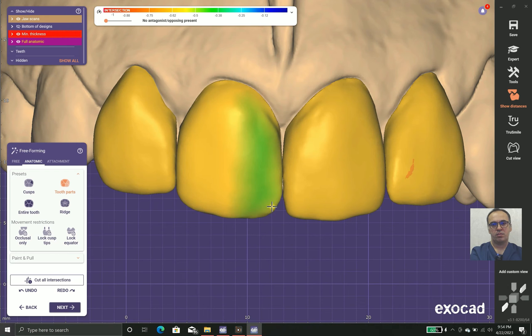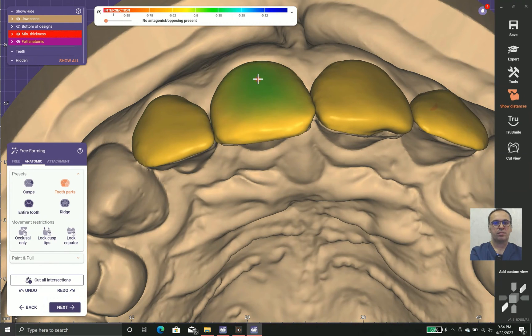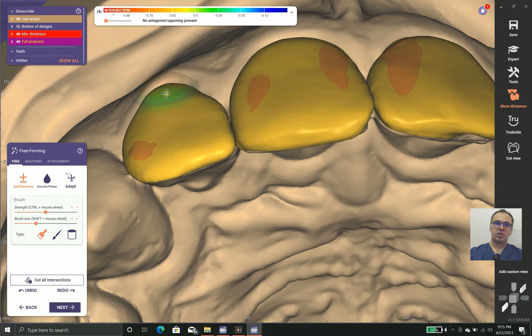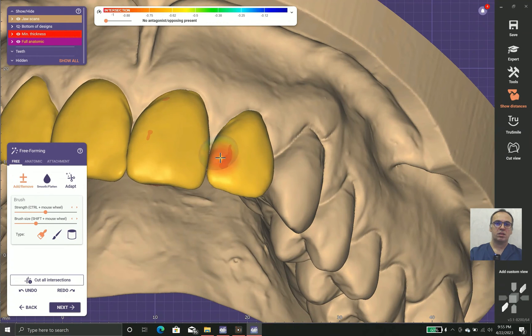As you can see, the mesial incisal angle is not as sharp as its neighbor. Sometimes we need to set the minimum thickness by hand, because the software enforces the anatomy without keeping minimum thickness in mind. So we should manage that ourselves and take care of the anatomy.